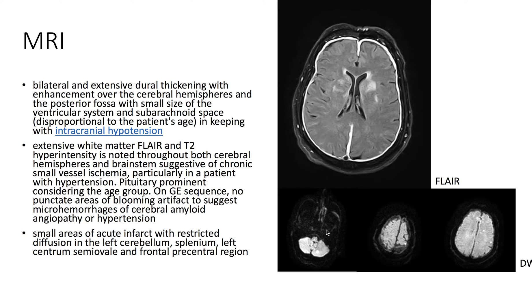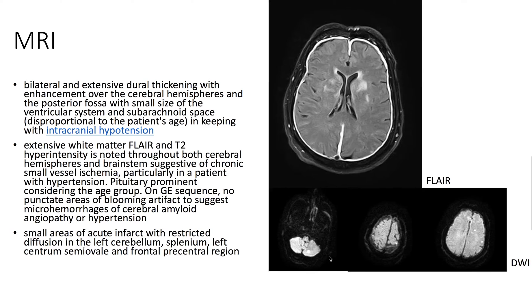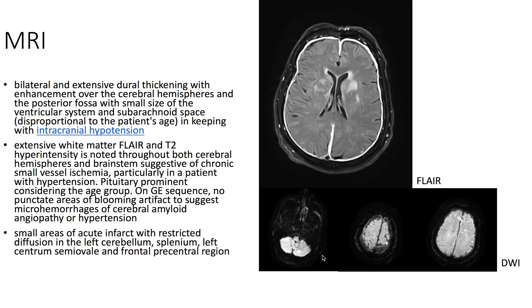Here on DWI, we see that there are small areas of acute infarct with restricted diffusion in the left cerebellum, the splenium, the left centrum semiovale, and the frontal precentral region.